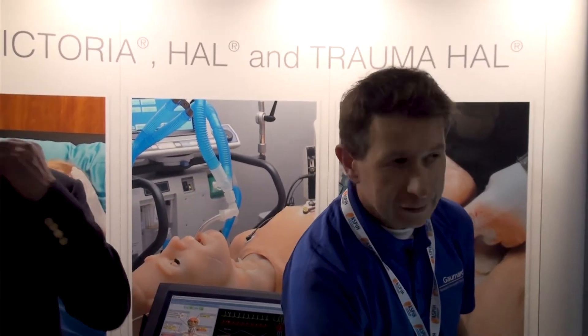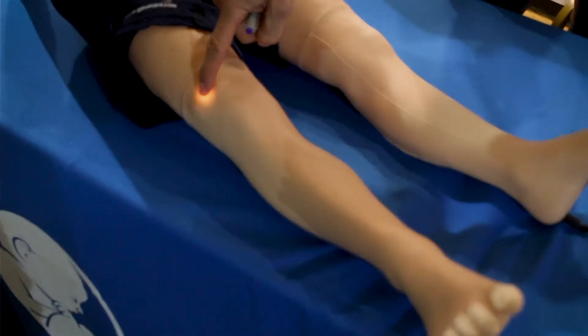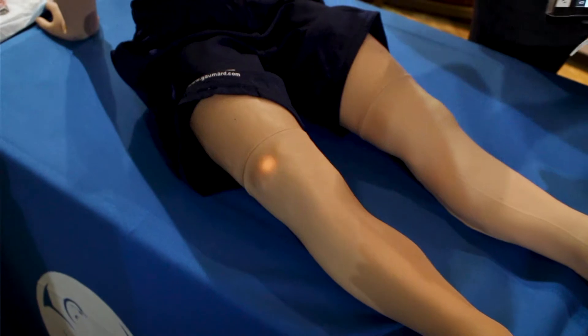You've got an IO in this leg here with a realistic tibia. You've also got a cap refill here in his leg as well.